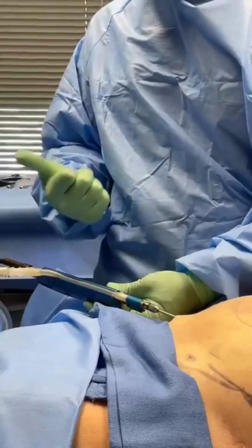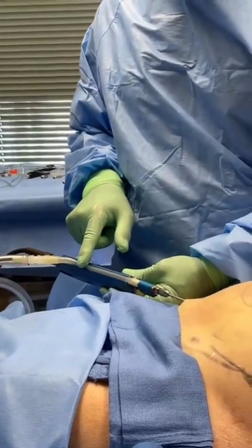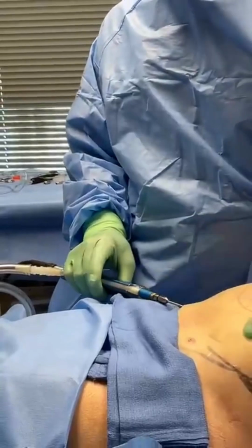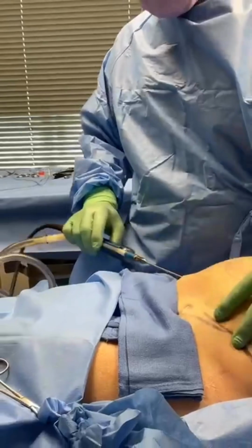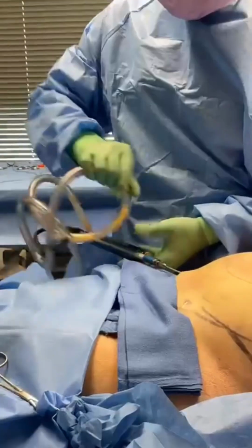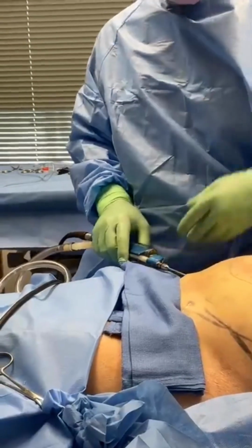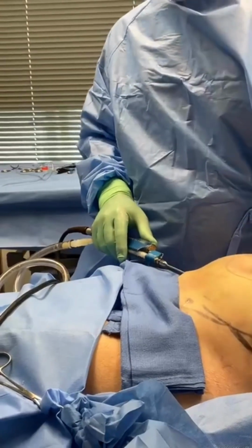Nothing's happening because A, there's no suction, and B, I'm not moving. So in order for fat cells to come flying out where they're out of here, I need to move and there needs to be suction. Now there's suction. I see the number up there on our equipment. And if I move, the cannula is going to start filling up with fat. And if you watch here, you're going to see the fat is starting to accumulate. If you look here in the tubing, you can see there's some fat. And we'll just keep going all over the abdomen and take the fat out smoothly and move on to the left and right waists, and then on the other side, the lower back and the hips.